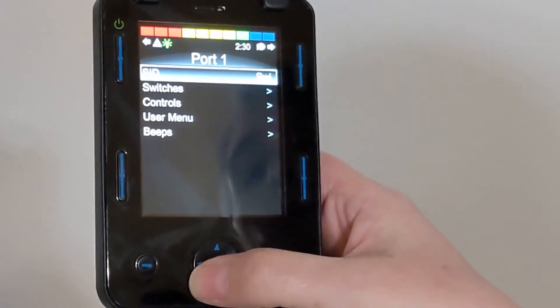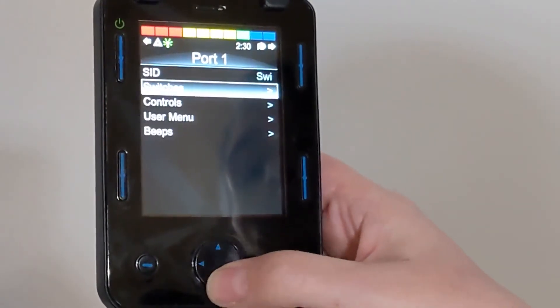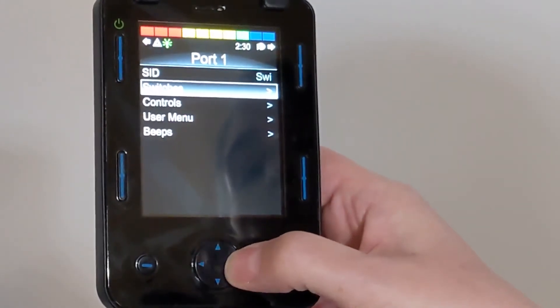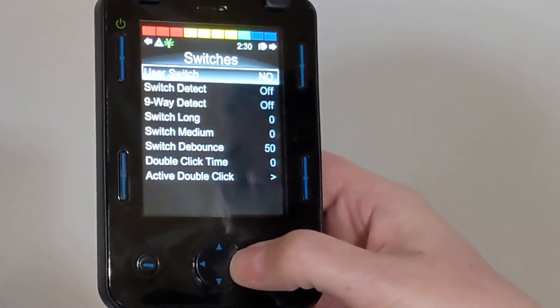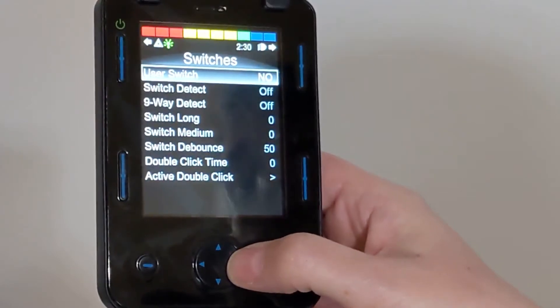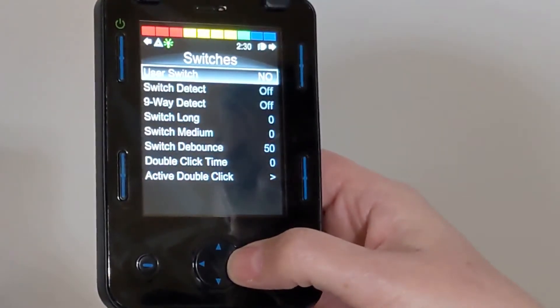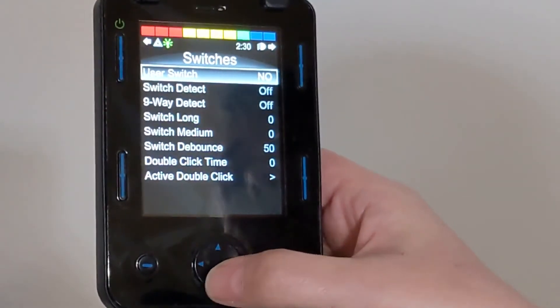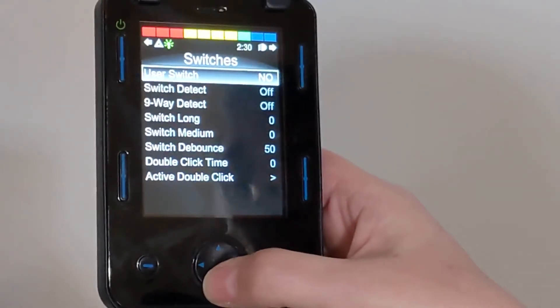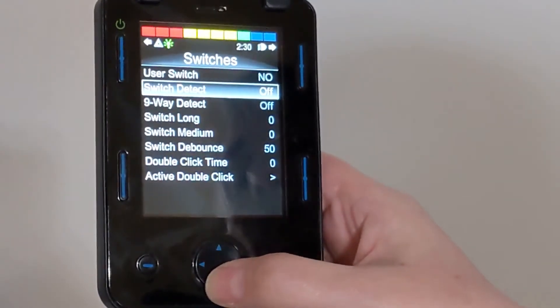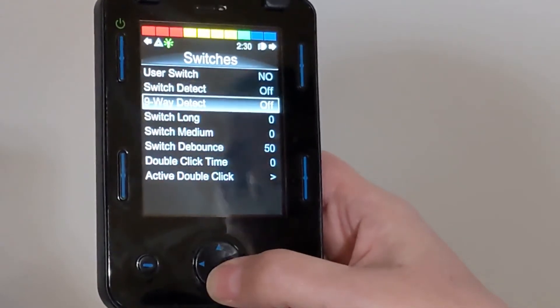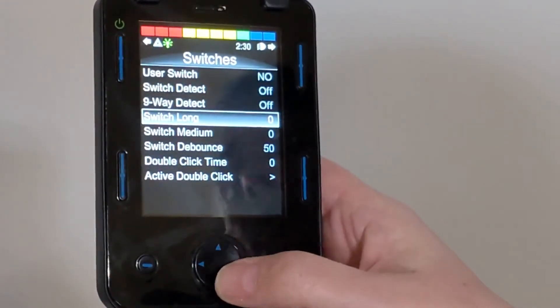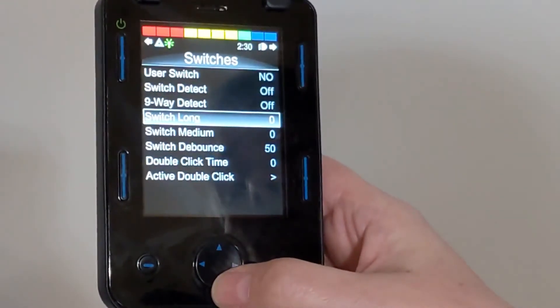Then we're going to go to Switches, and we're going to make sure that User Switch is set to NO, Switch Detect is set to OFF, and Switch Long is set to 0.